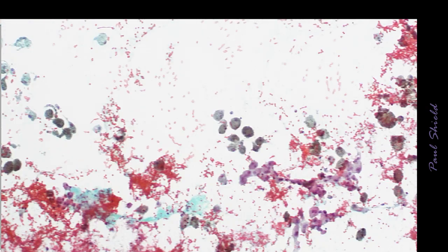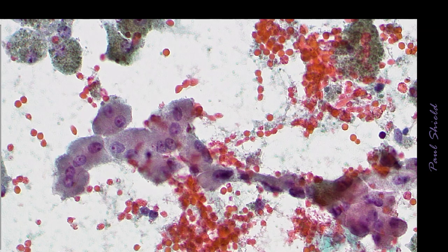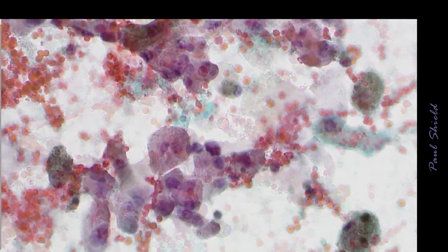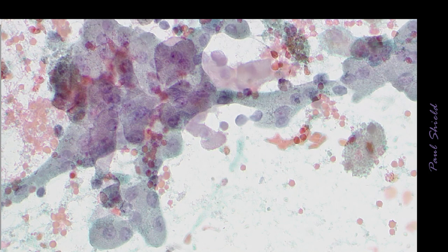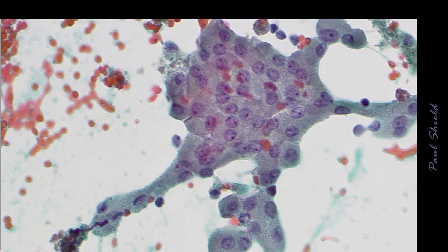And then see in the middle here a sheet of epithelial cells, and even at this power I can see they have eosinophilic granular cytoplasm. Same features, quite a pale nucleus and fairly large nucleoli, and quite a bit of binucleation. The cells are forming these flat sheets that don't have obvious cellular borders in between them.